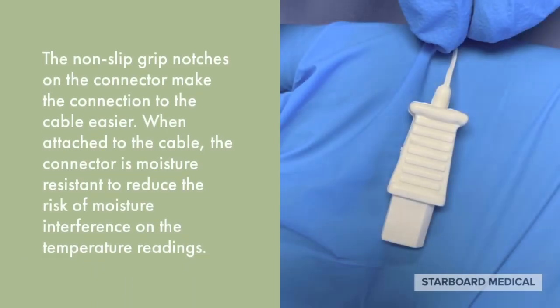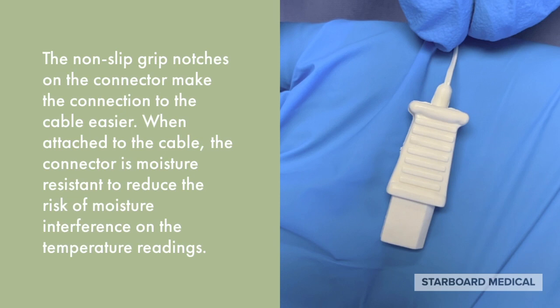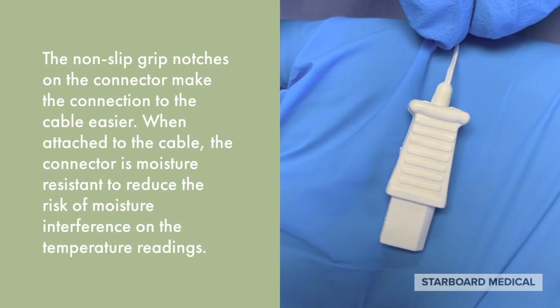The non-slip grip notches on the connector make the connection to the cable easier. When attached to the cable, the connector is moisture-resistant to reduce the risk of moisture interference on the temperature readings.